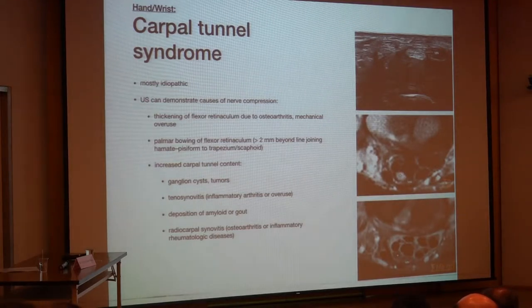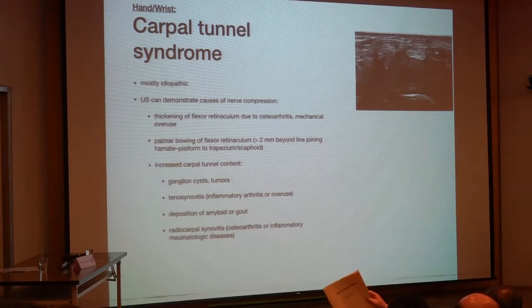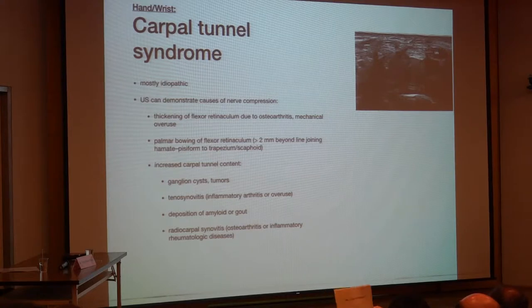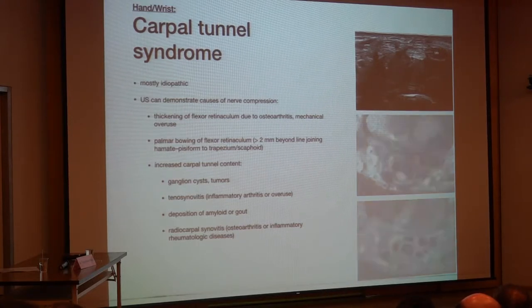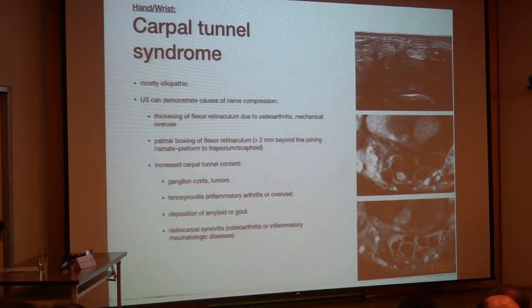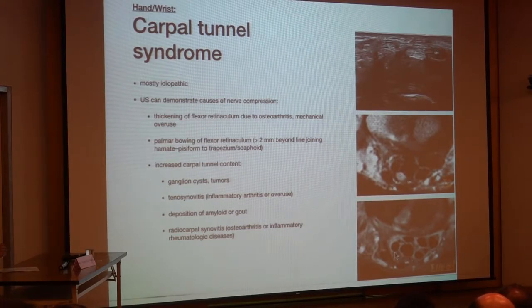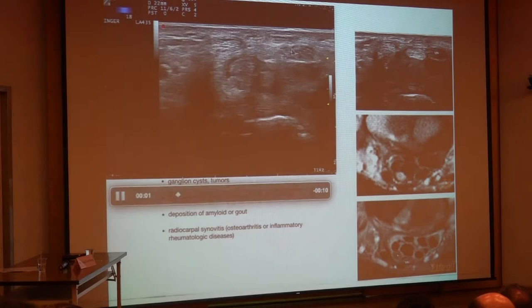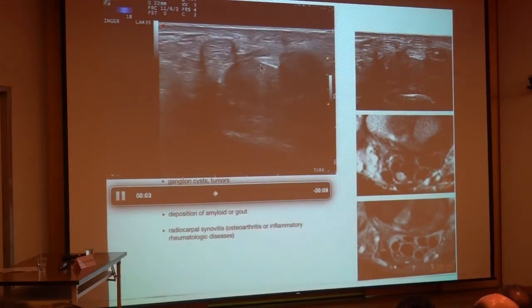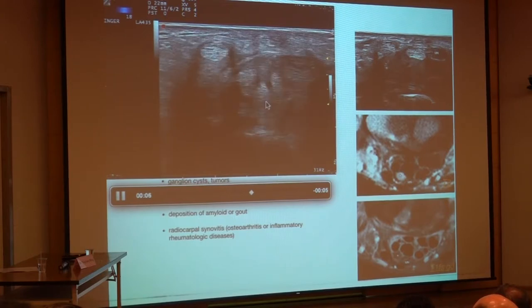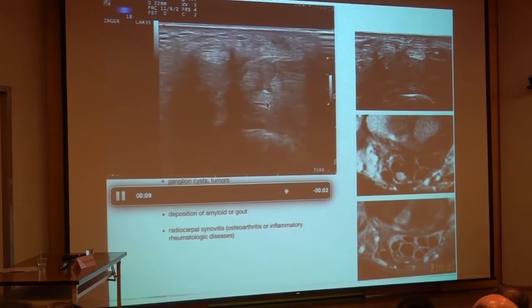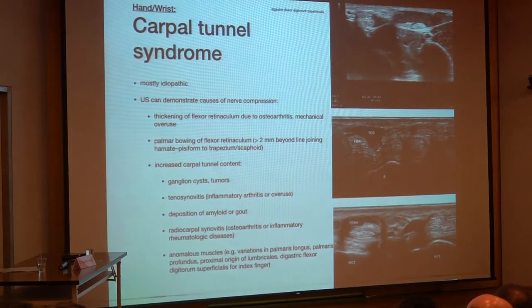Here is an interesting case. We can see the median nerve and an adjacent echogenic structure, which could be mistaken for a flexor tendon. MRI has shown that this structure is a small lipoma — on the T2-weighted sequence and the fat-suppressed sequence, we can nicely confirm this. In the video, you can see the median nerve, then this small lipoma, making the differential diagnosis from a normal flexor tendon more easily observable.